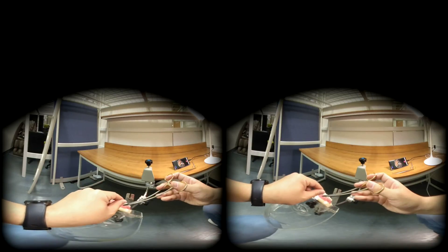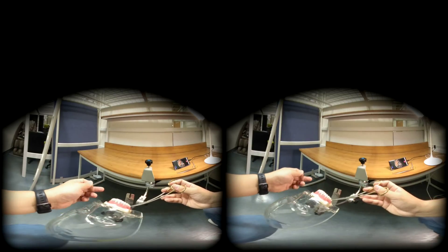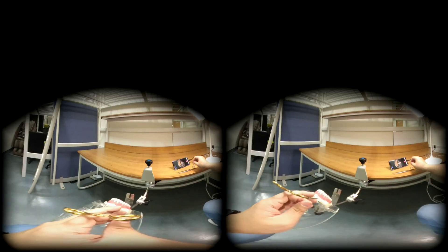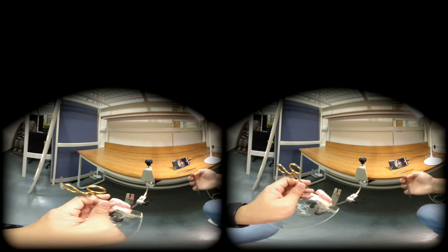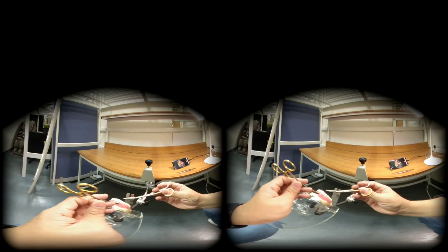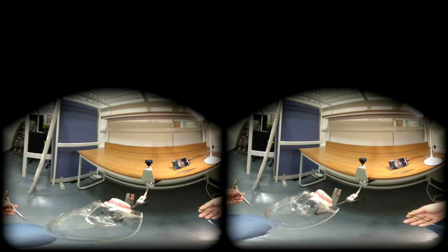If you want the extra knot, the rotation doesn't matter — you create an extra knot. It's a two by one by one surgeon's knot. And you cut the silk three to five millimeters away from the knot. This is the conventional surgeon's knot.